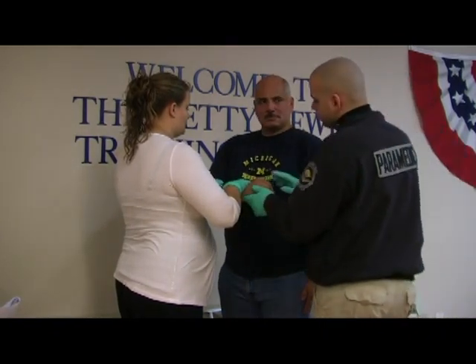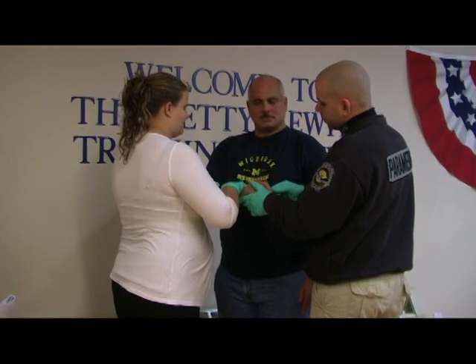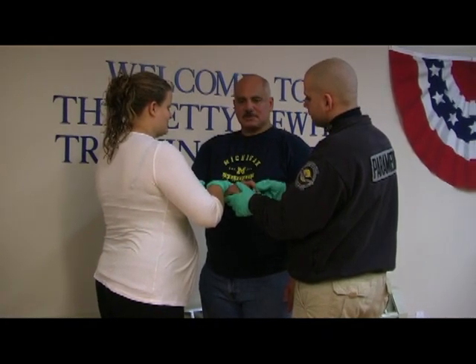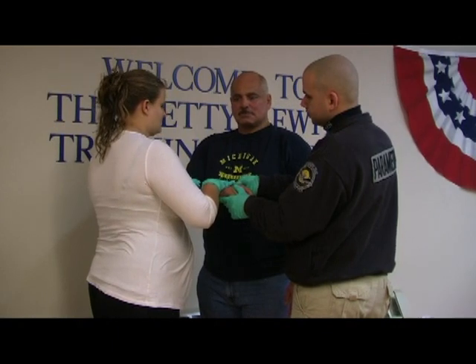First thing I'm going to do is check CMS. Sir, can you squeeze my finger? Do you feel me touching your finger? And check for the presence of distal pulse. CMS is present.